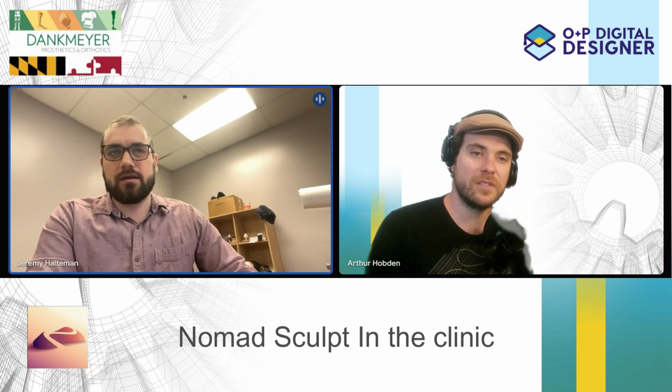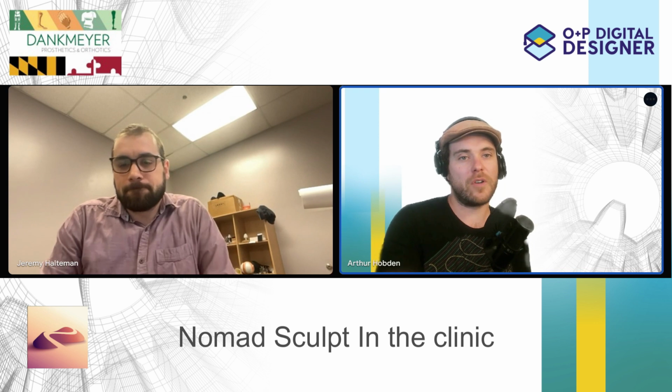You can decimate, you can subdivide, you can do anything, and remesh forcing a higher percentage of symmetrical triangles, or remesh with a low percentage of symmetrical triangles. The mesh tools and the remeshing have greatly improved to the point where that's pretty much all we use. There are times we'll push something to voxel just to make it simple. The close features in voxel tend to work a little bit better, but you can still usually get them to work with meshes by manually closing the holes.